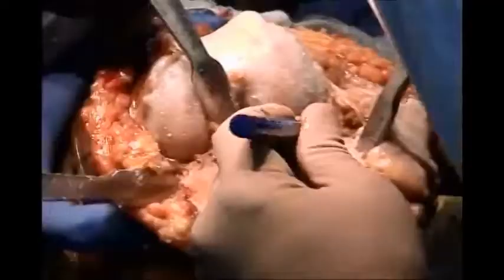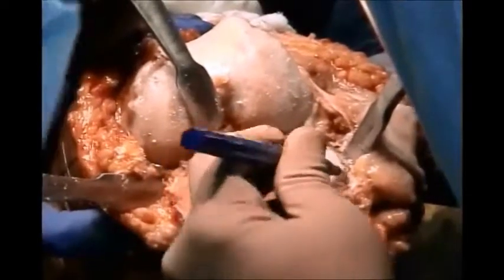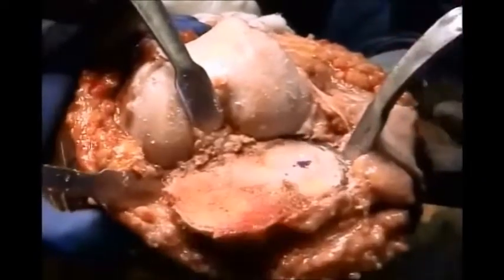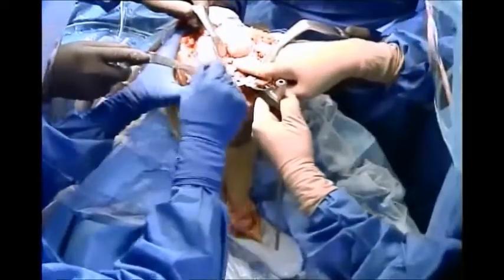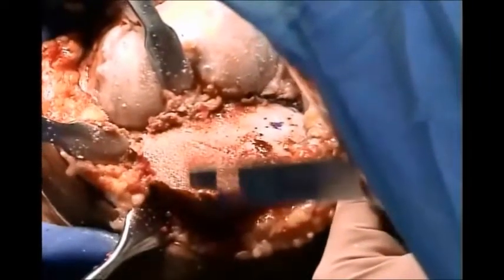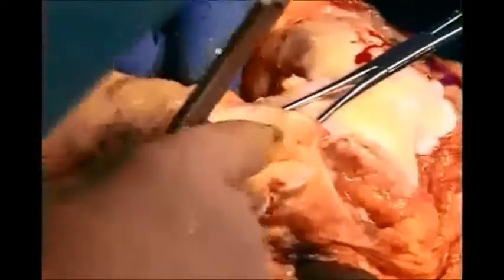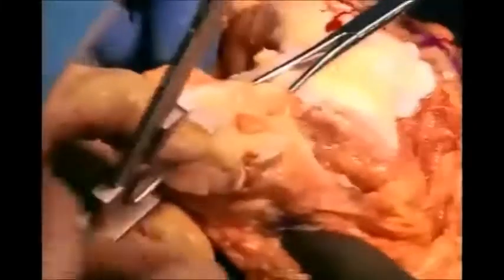Detach the soft tissue from the posterior side. It is important to mark the cut surface of the lateral tibial plateau. You put an appropriate size tibial plateau which measures that dimension, and I reduce the medial side equal to the lateral side as the tibial component is symmetrical.